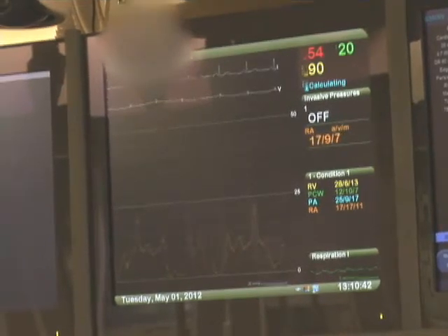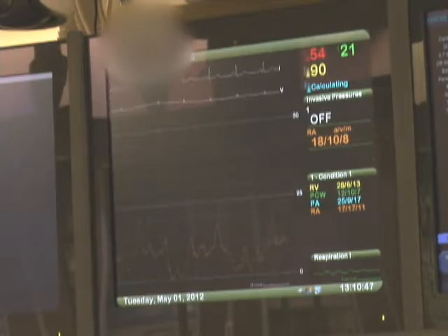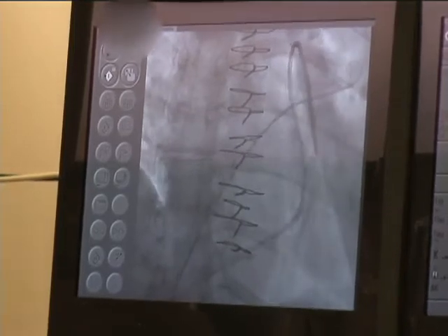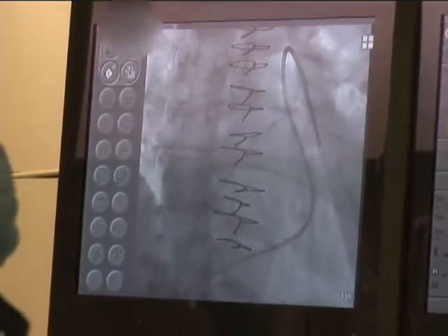The multipurpose catheter is advanced over the guide wire into the left atrium, and position confirmed by measurement of left atrial pressure and oxygen saturation. Heparin is now administered. The catheter is advanced into the left upper pulmonary vein and oxygen saturation measurement is repeated.